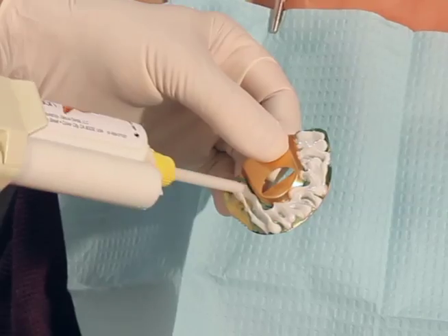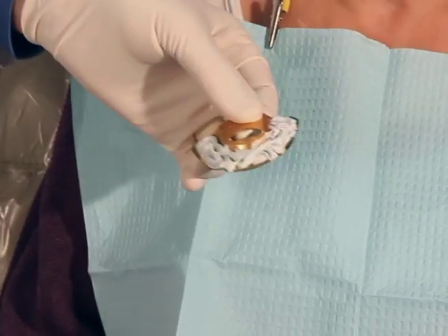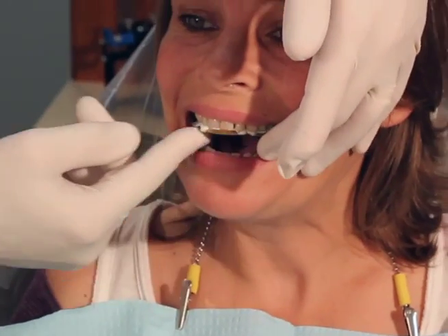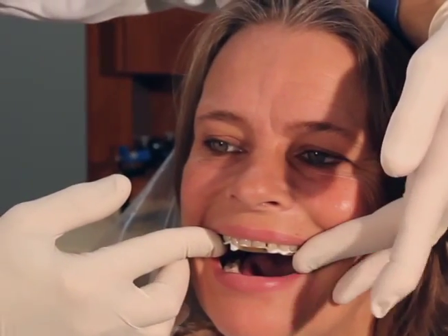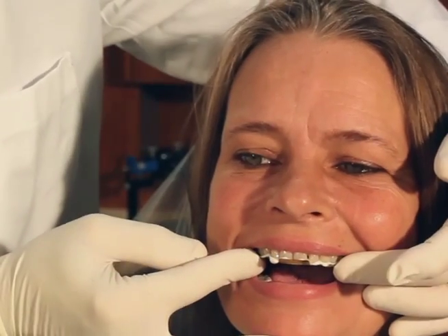We can add a very thin layer of bite registration material to the upper side to get a registration of the upper teeth. This is fast-setting material so we're going to work real fast. Open please — I want you to just tap-tap and open. I'm going to hold this against the upper teeth while the material sets. When you go to remove the tray, don't just pull down or you might warp the tray.